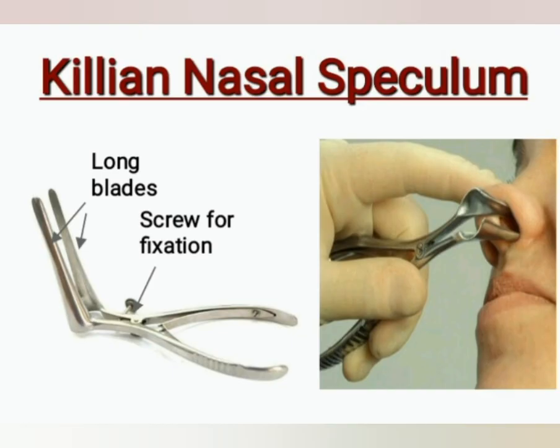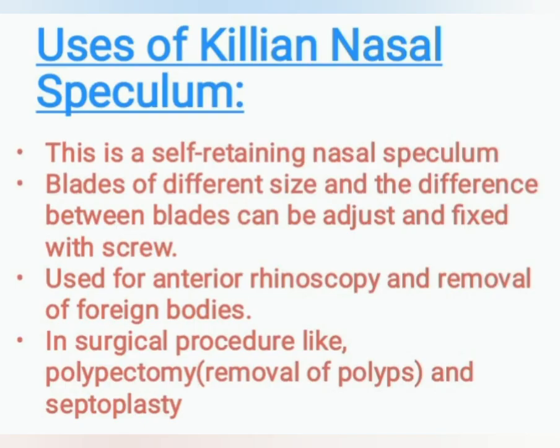Third, Killian nasal speculum. You can see in the figure how to examine the nasal cavity through the Killian nasal speculum. Killian nasal speculum has two long blades and a screw for fixation. See, there are uses of Killian nasal speculum.